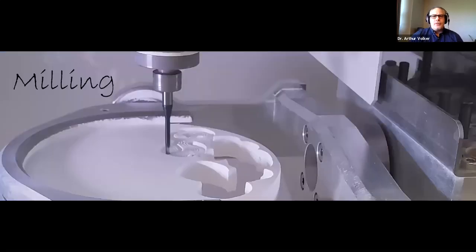Now, this is just a photograph of our mill. This is a dry mill of a zirconia puck, and this is what it typically looks like. It basically looks like a big hockey puck. You place it into the dry mill, and it's done. It does create a lot of dust, so you do have to be careful in terms of filtration and things like that. But this is a very efficient way for those who are doing a lot of zirconia.